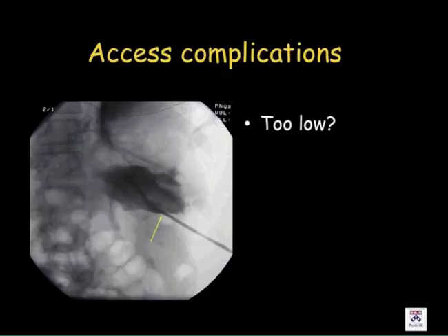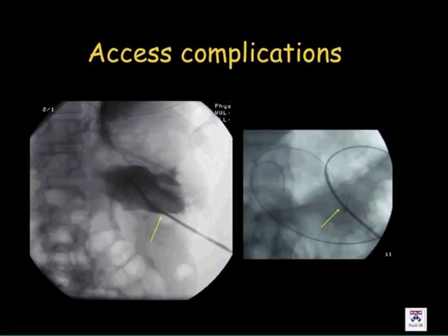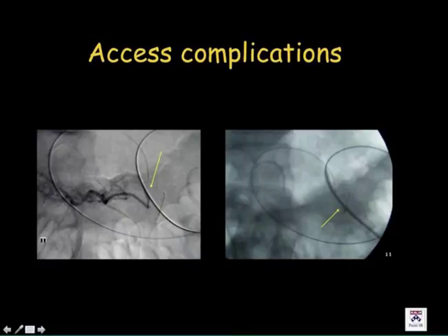So here, a little bit of blood coming, and theoretically you can say, maybe you have to wait a little bit, but the problem is the patient you are with. So we decided to do an arteriogram, and as you can see, we swept the gastrostomy tube over a guide wire, because otherwise the tube will tamponade the tract. When we inject contrast into the gastroepiploic artery, you can see that the tube perfectly transects it.